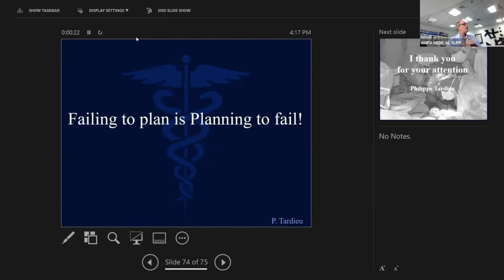So finally, I want to tell you this: failing to plan is planning to fail. It's not from me. I've been hearing that since a long time in New York University. Planning is key to success. So planning implants in computer-guided implantology is key to success. Never, ever forget that.